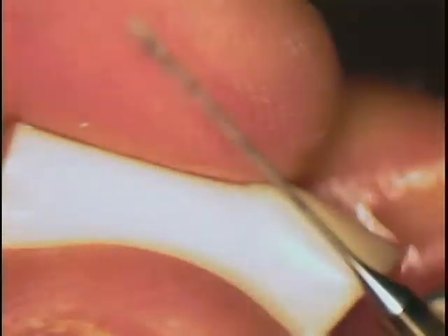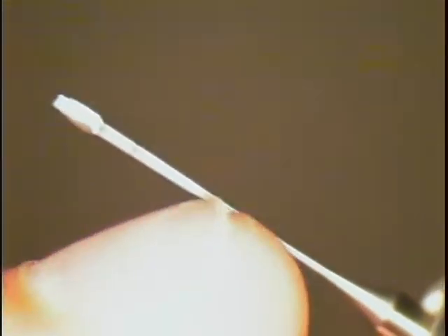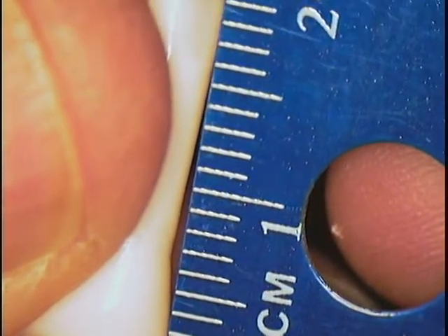Okay, so how do you measure 2/3 the distance? Well, you measure the length of your tooth, and then you mark. You're going to have to mark your burr with your Sharpie. So measure the distance, and we'll measure that 2/3 the distance. I'm going to guesstimate 14. Okay. So from the tip of the lingual canal now, let's see, that's going to put us right about there.